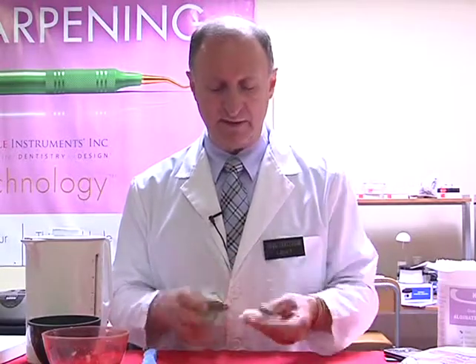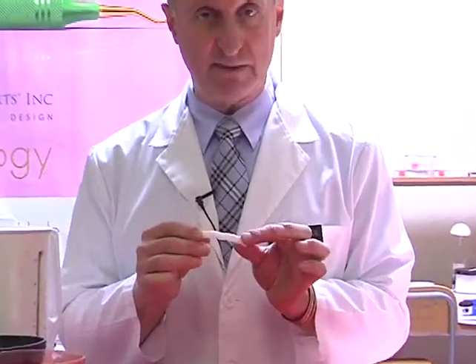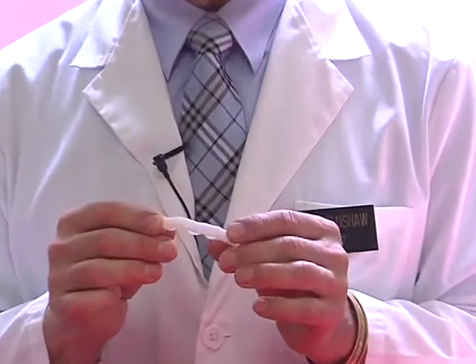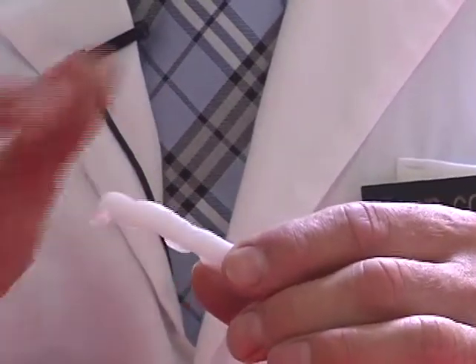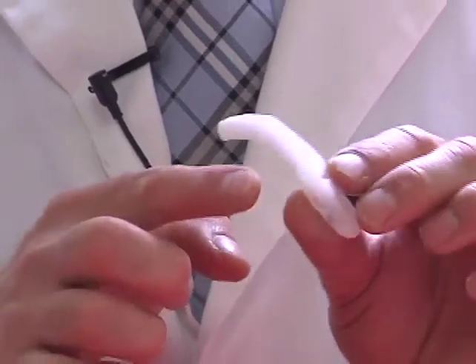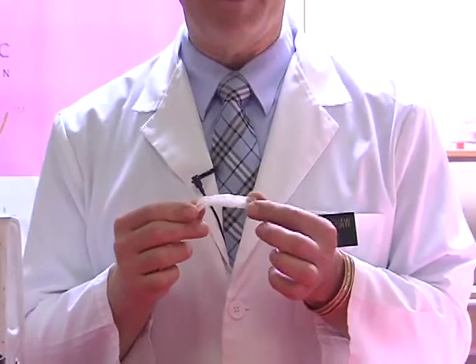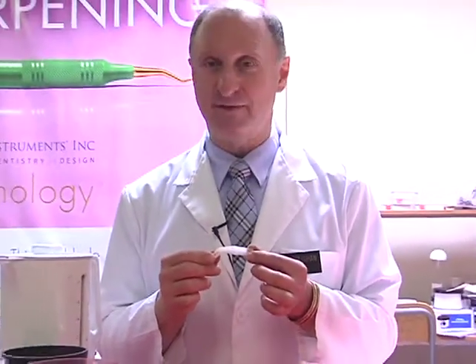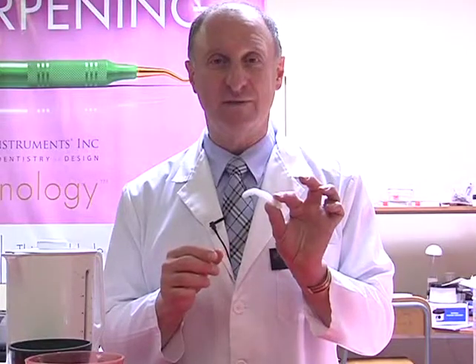So we remove it, and we're left with an easy material. We can trim this with a scalpel blade, with some scissors, or even using a straight handpiece with a cross-cut rosehead burr to trim in between. And that's how to make a bleaching tray inside the mouth immediately. The whole system is very fast and very convenient. It's going to run you about $2.40.